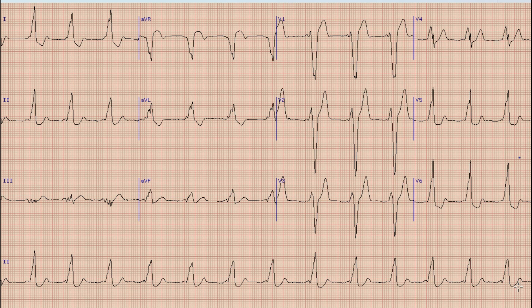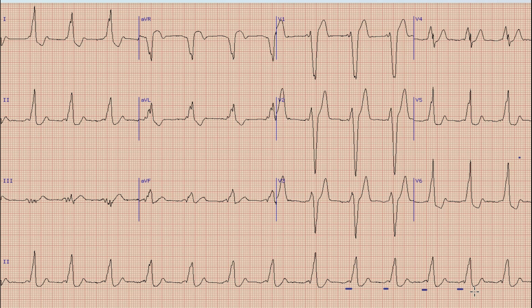Let's begin the discussion on this ECG. As you know, the first thing we look at on an ECG is the presence of rhythm. As you can see in the rhythm strip, almost every QRS complex is preceded by a P wave. The presence of an upright and prominent P wave before each QRS complex means that this is sinus rhythm.